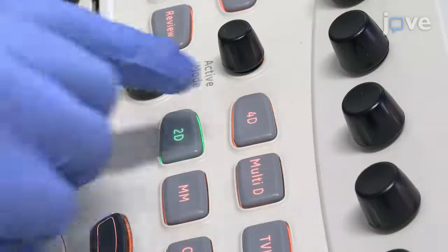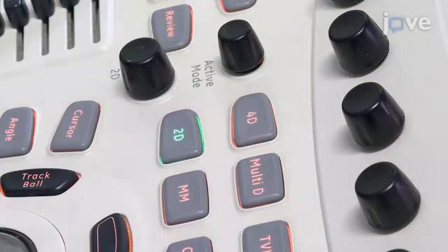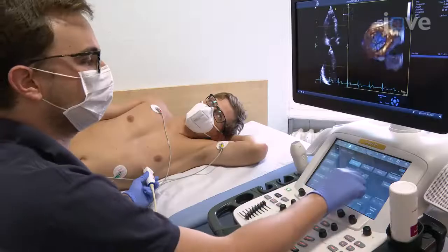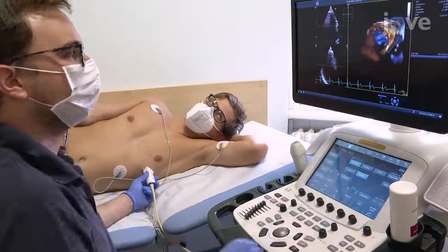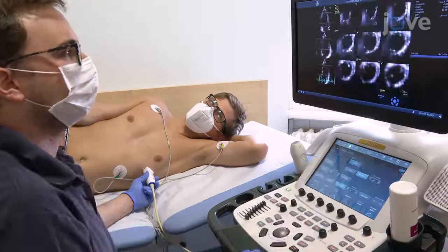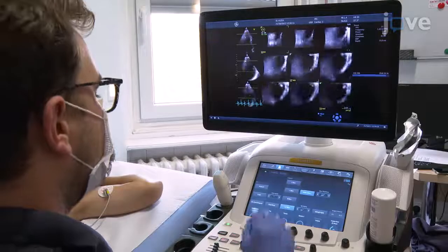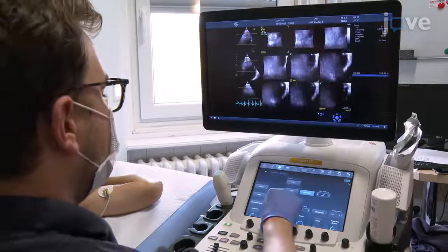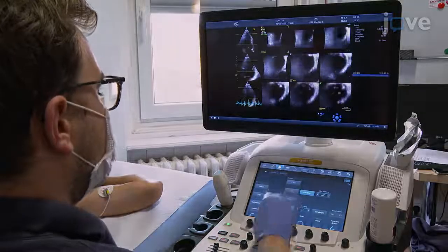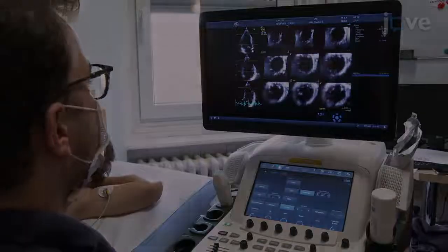Press the 4D button to switch to 3D mode and acquire 3D images in the multi- or single-beat mode. Use the multi-beat mode to achieve a higher spatial and temporal resolution from which the dataset is generated.